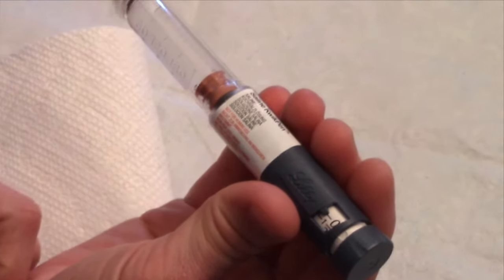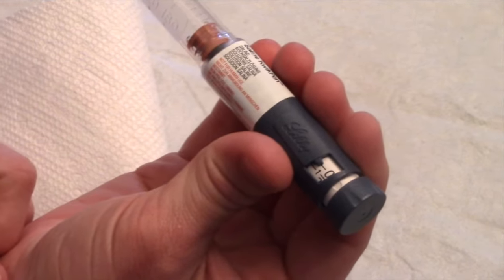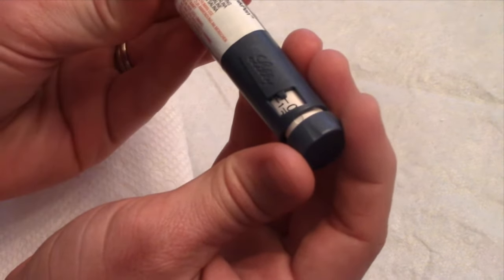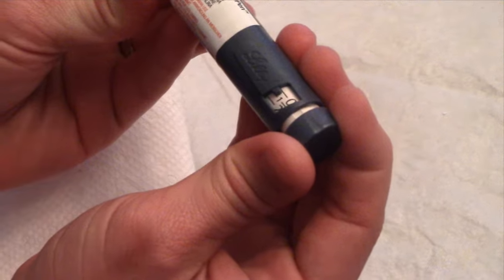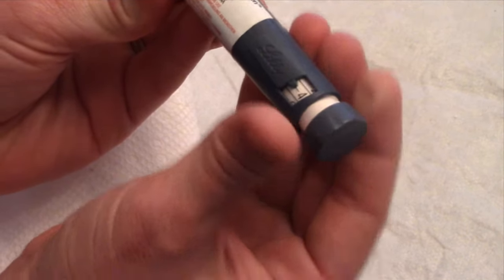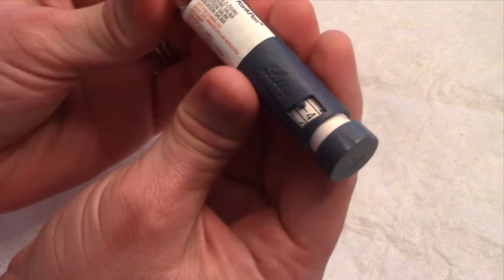Now that the insulin pen is primed and ready to go, we're going to set it up to administer insulin. For practice purposes, we'll say we want to deliver four units. Turn the knob until you see the four. Now we are ready to administer the insulin.